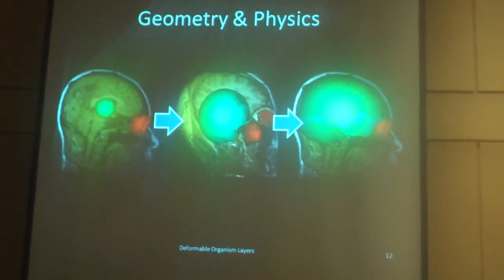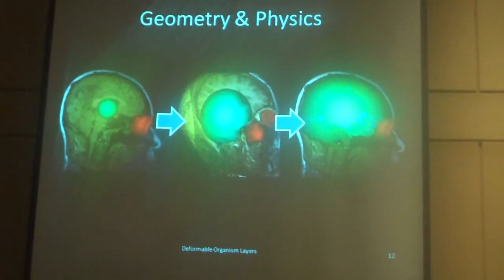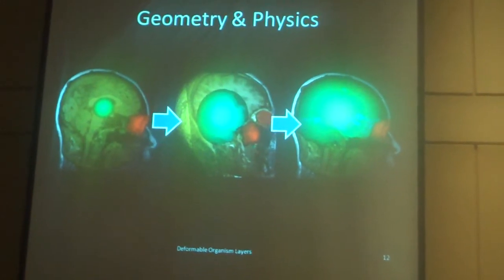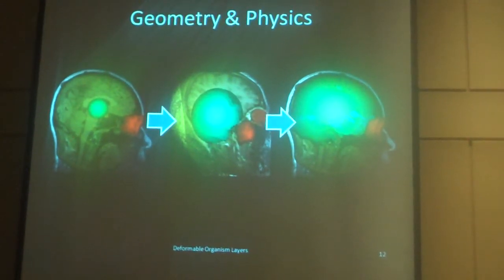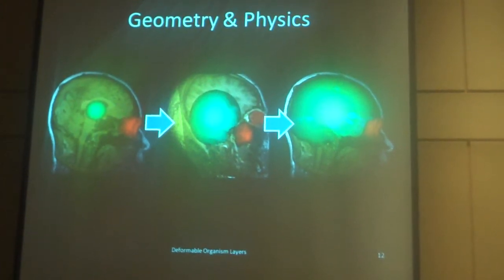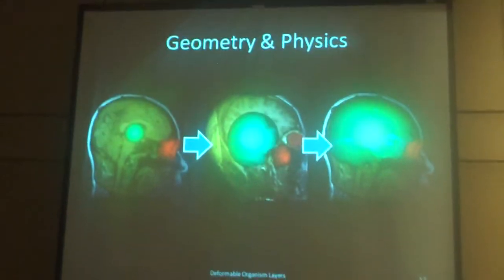Each of our organisms is represented as a 3D triangular mesh. They start as a sphere, and we iteratively deform them to model whatever region we decide the organism should find. At every iteration, we apply Laplacian smoothing to constrain the way the mesh deforms. For example, we don't want the meshes to intersect with themselves, and Laplacian smoothing will prevent this.